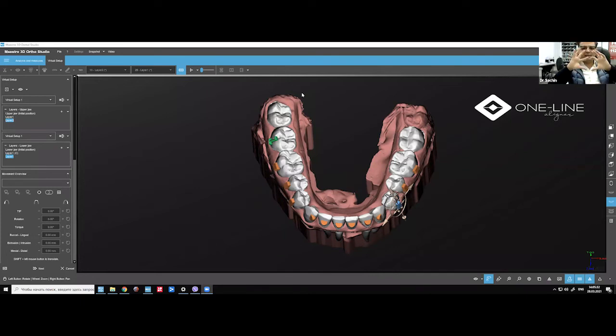So I think it's a combination of everything. It's a combination of the sheets, tooth size, root size, and attachments also. Yes. So I can just show you one case where we did a lot of retraction, and I'll show you what attachment we used on those. Okay. Perfect.